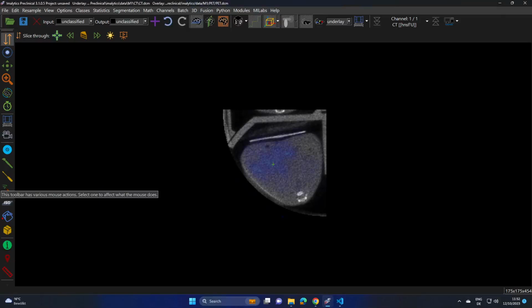This script can be used as a reference to perform some image processing operations and as a reference to save and manipulate DICOM images. With that, we have come to the end of this tutorial.